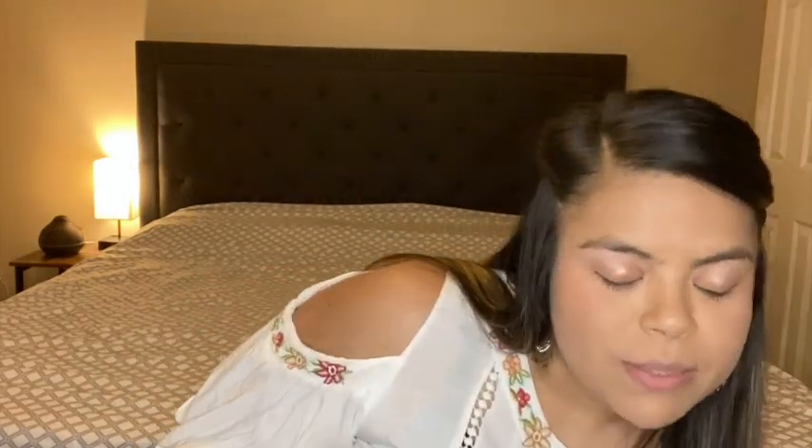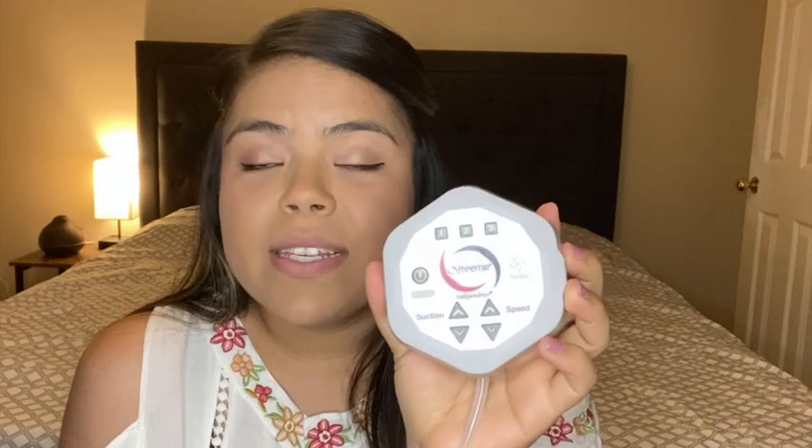The suction is great. You do have to play with the settings to find what works for you — you can adjust suction and speed. It also has three different modes, and once you find the mode that works best you can save it. So when I'm pumping at work I just turn it on, hit setting one for a few minutes, then hit two — all my settings are saved.